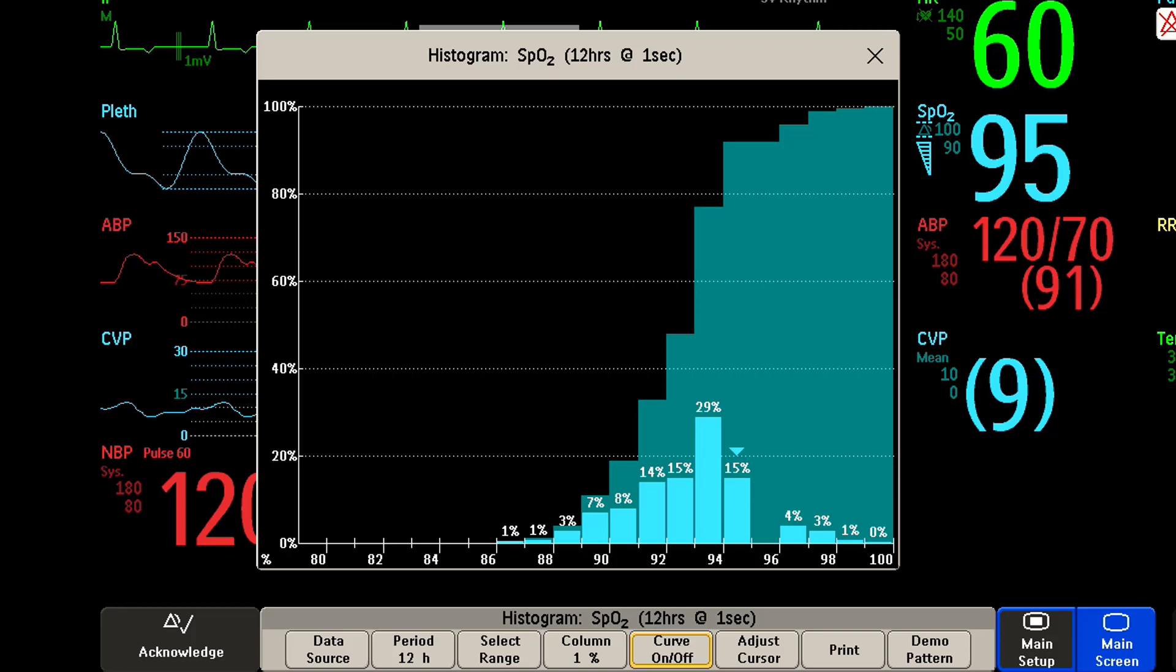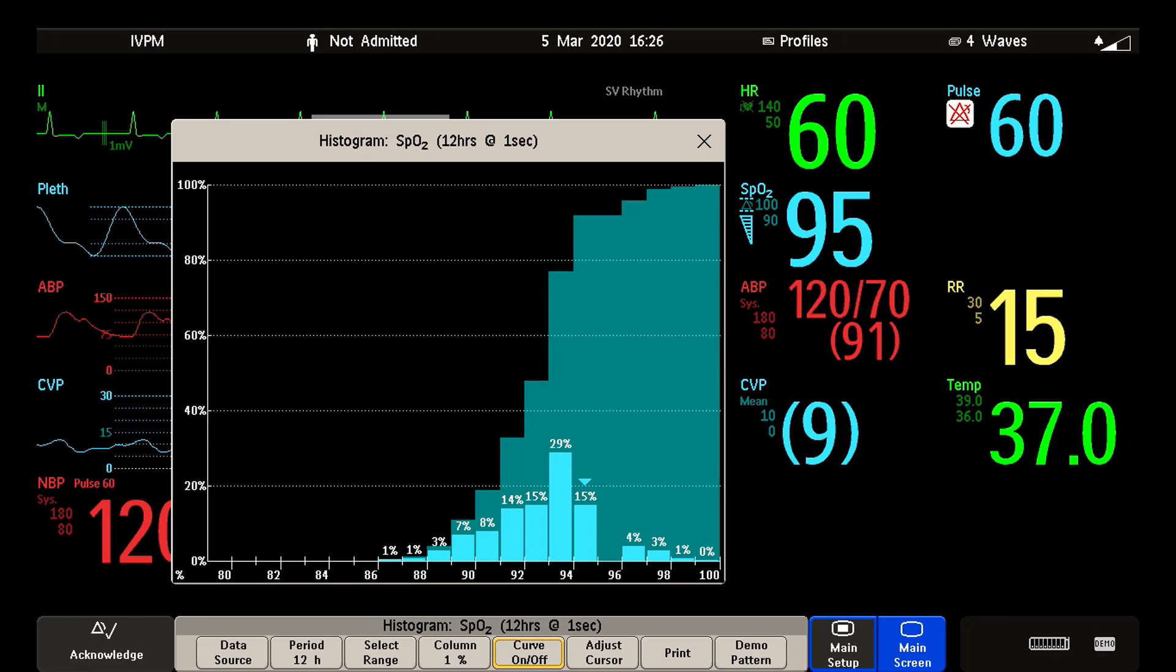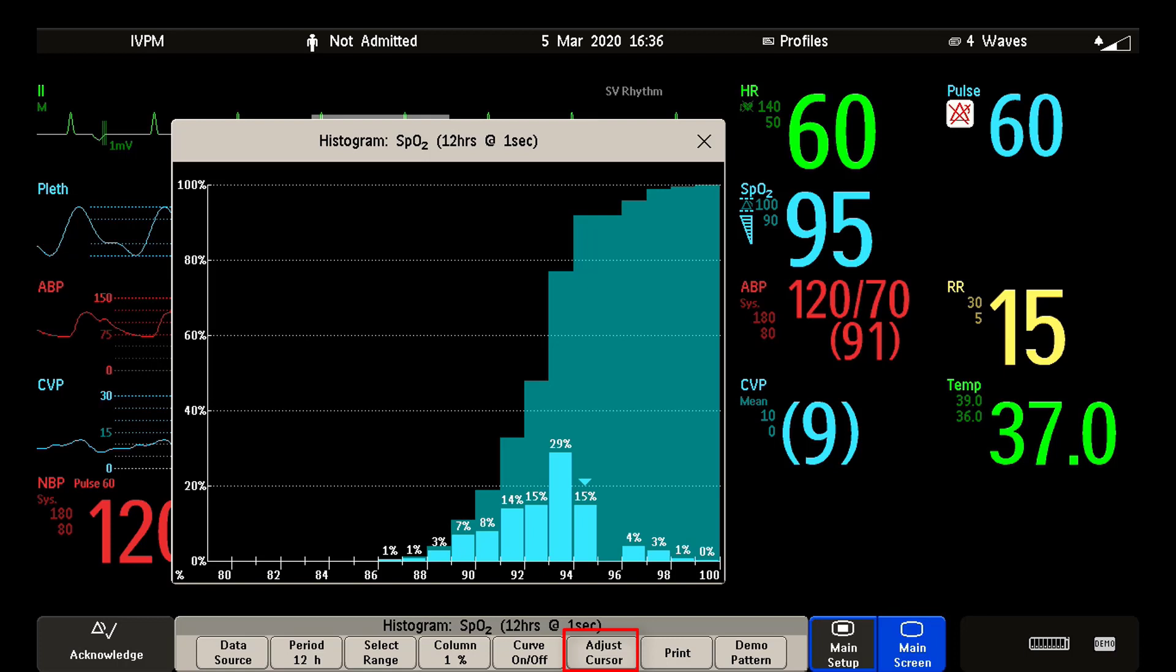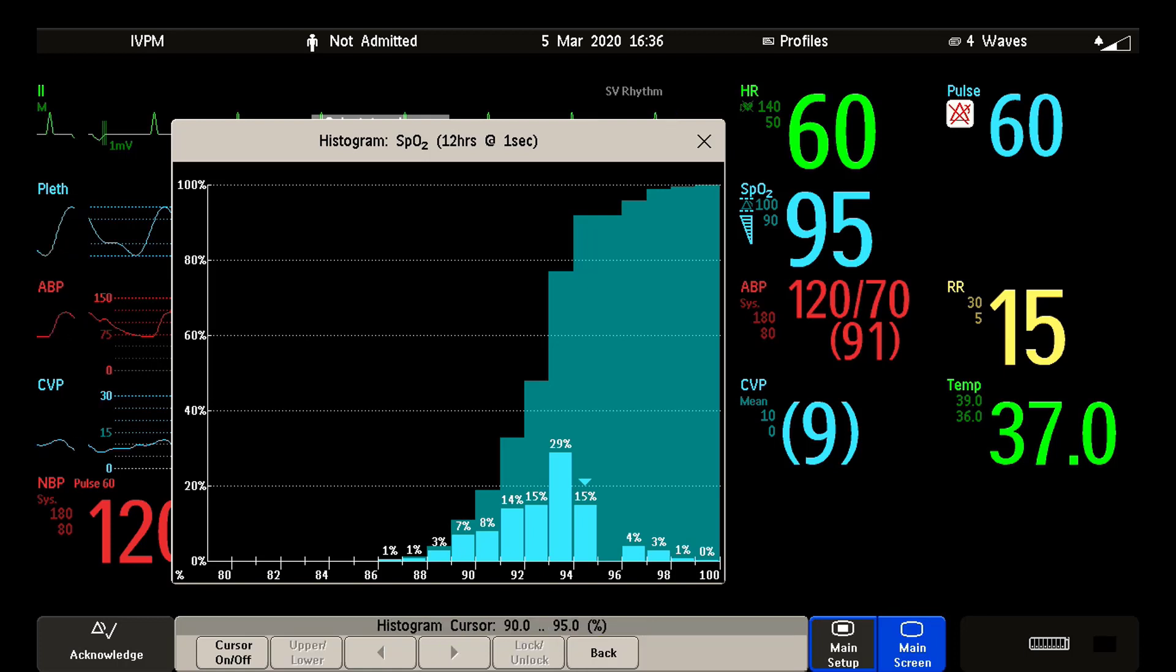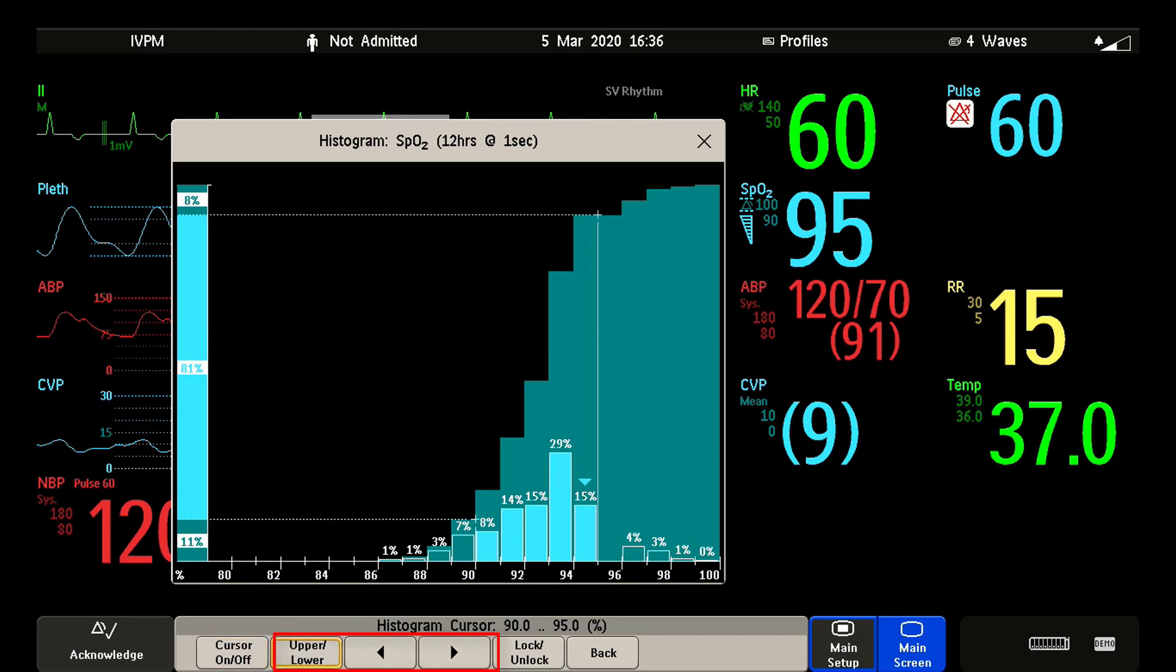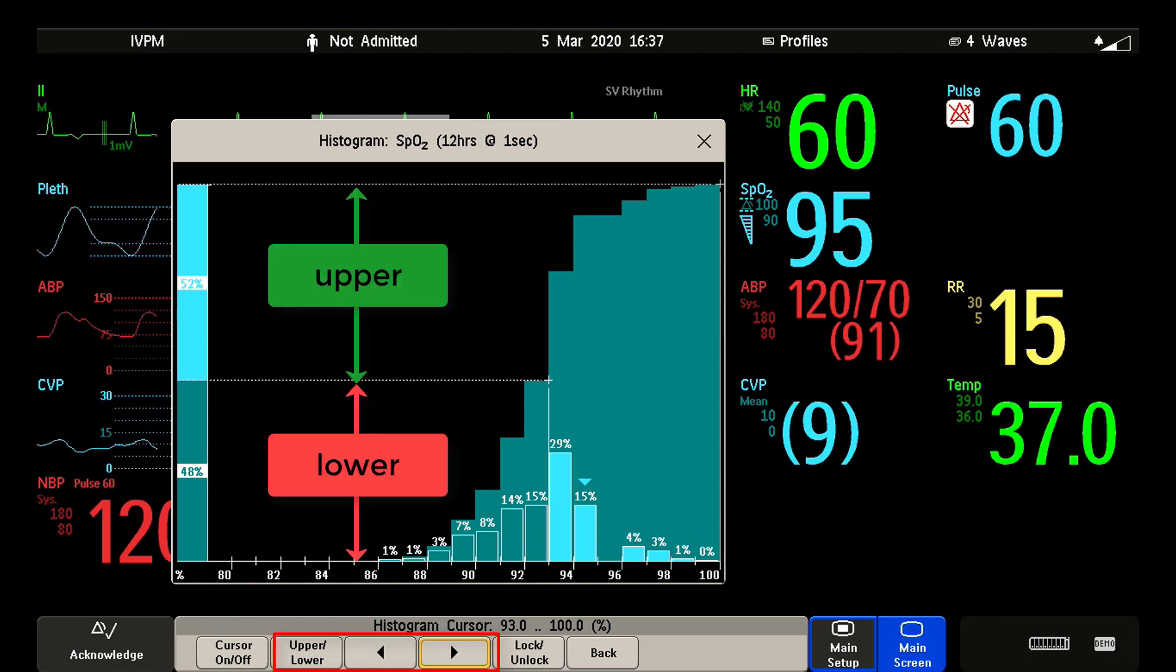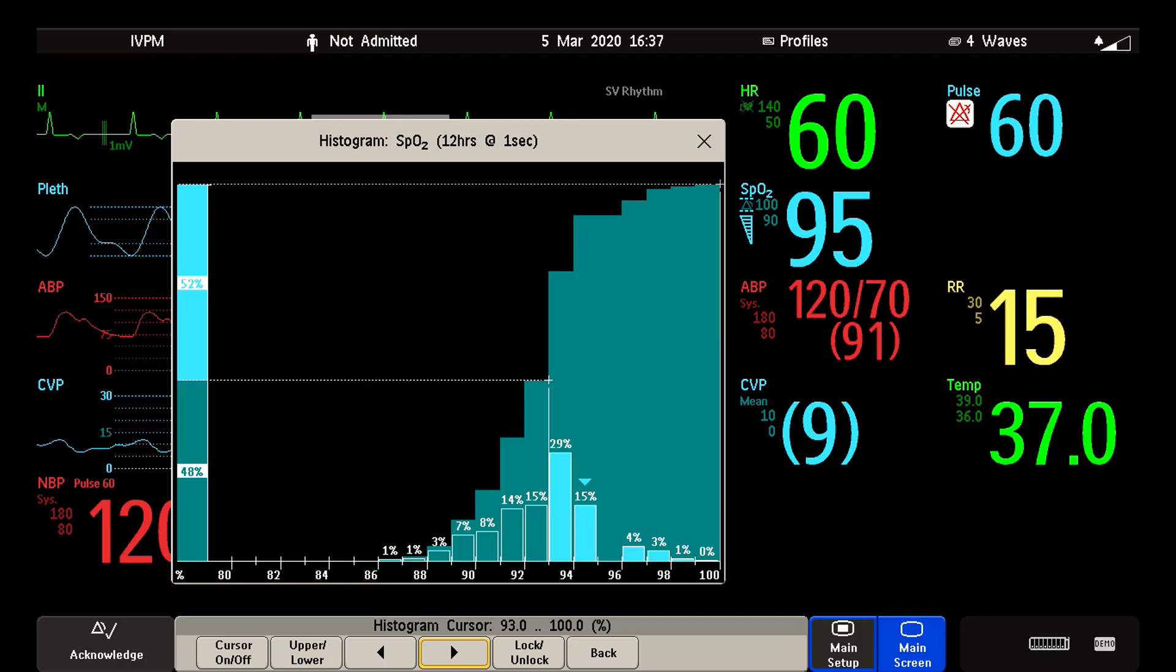One other great feature is that you can span a corridor with two cursors. This way you can divide a histogram into in-range and out-of-range areas. Or you can set both cursors to the same value and then use them as one cursor to divide a histogram into an upper and a lower segment.